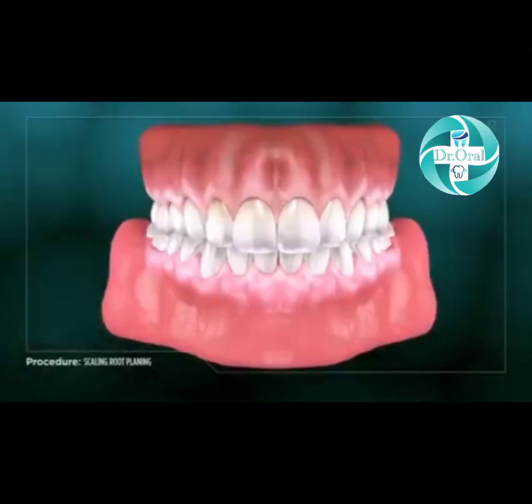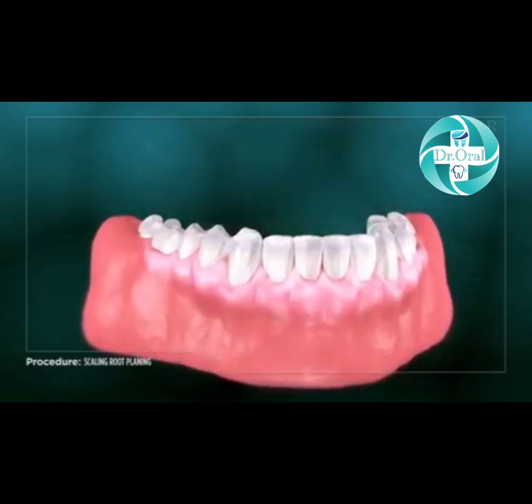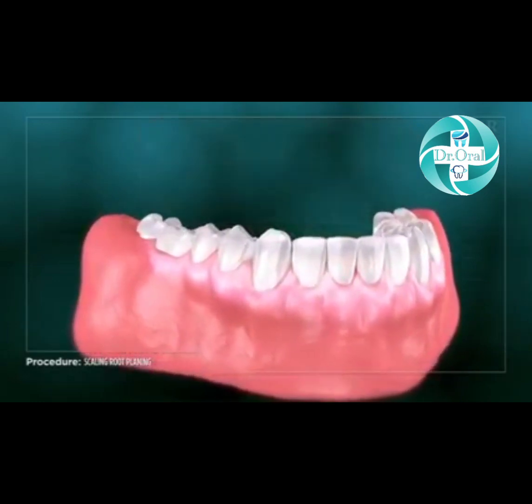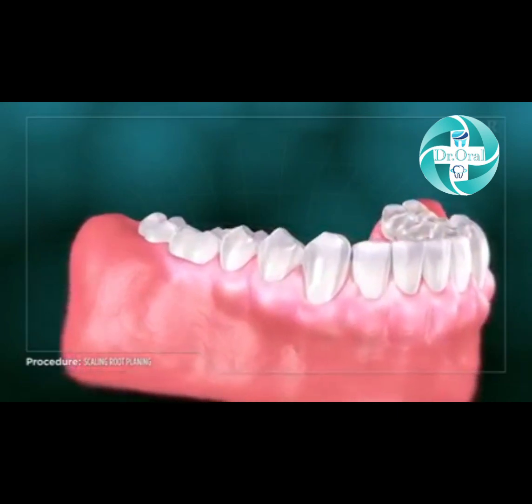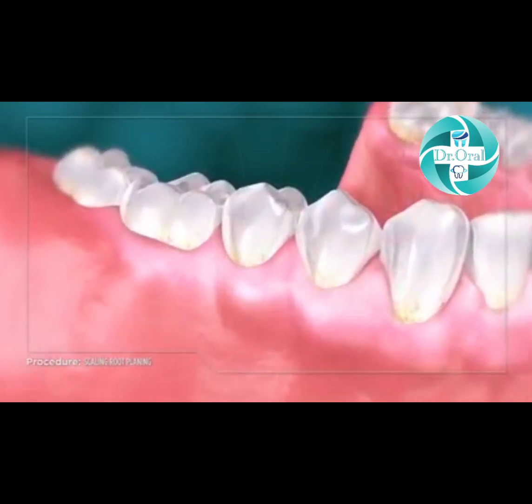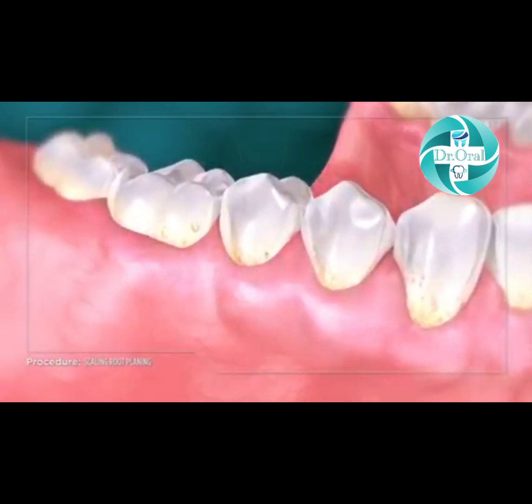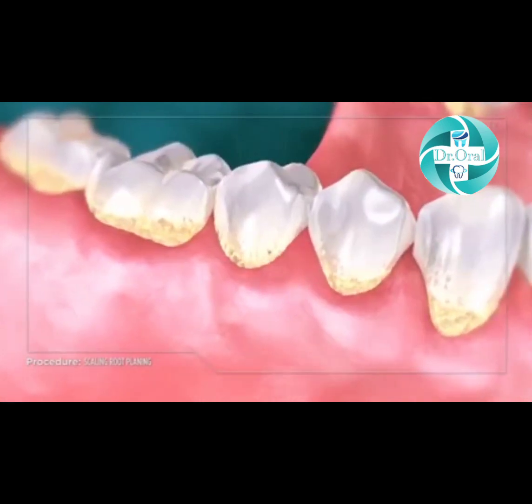For many reasons, sometimes people aren't able to maintain the recommended frequency of dental checkups. Oftentimes, when an extended time has gone in between cleanings, a more advanced cleaning may be recommended by your doctor. Harmful bacteria and hard tartar deposits called calculus build up on your teeth above and below the gum line, releasing toxins that cause gum disease, also known as periodontitis.